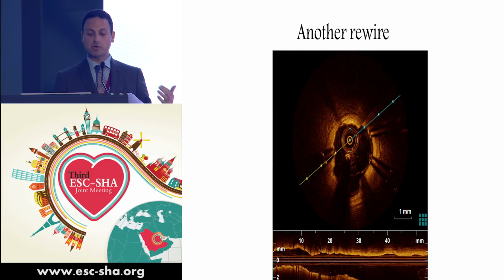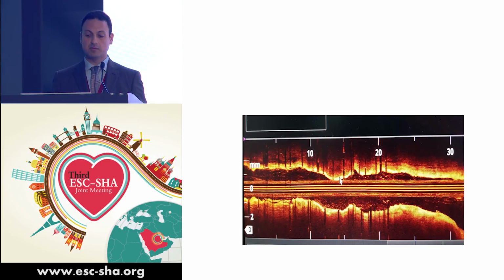Taking more and more time, making bigger loop of the wire, I could recross again and repeat the OCT, and this is a picture I have. I can see my struts on both sides of the catheter, so I am perfectly inside the stent all through.